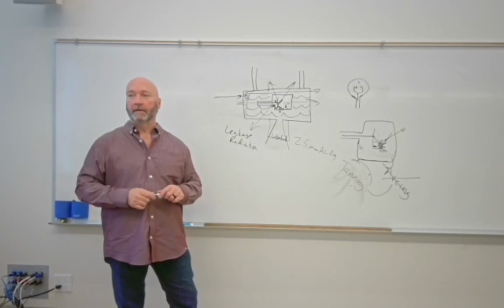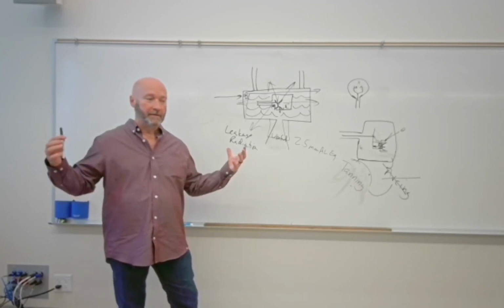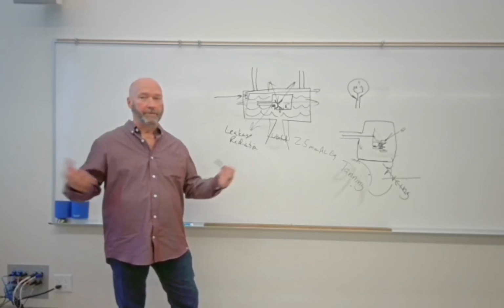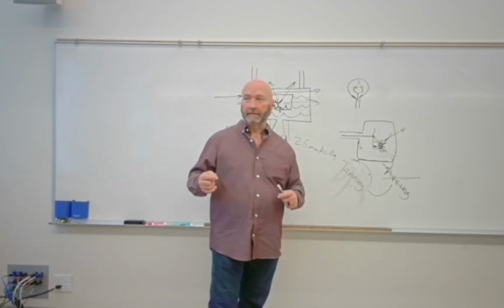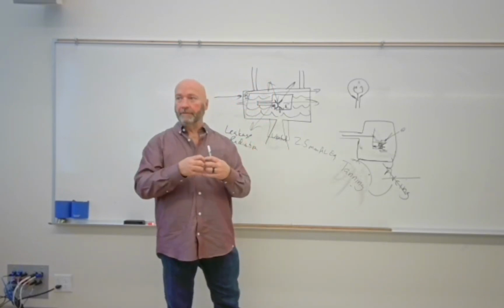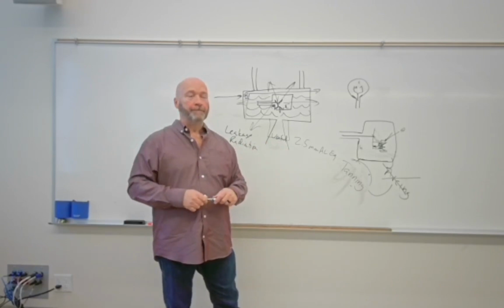What's it going to look like? It's going to be deflated. It's not because you've lost molecules. You can take it back out, let it heat back up, and it'll reinflate. So heat and cold affect different things. You get shrinkage in cold stuff, and expansion in hot stuff.